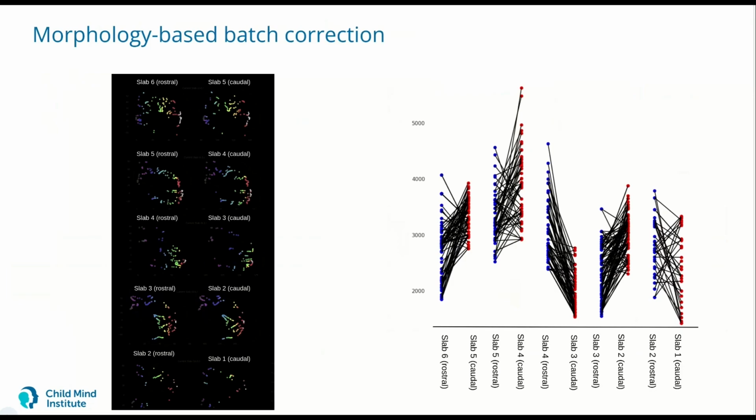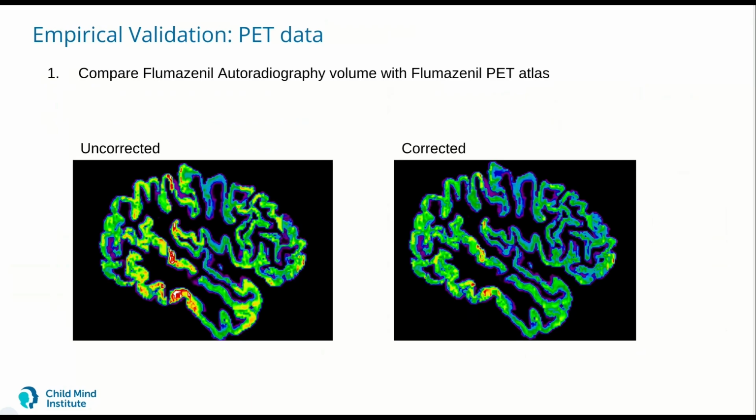To maybe illustrate that for you a little bit, here we have the paired vertices in each of the adjacent bits of cortex. Here we have the rostral portion of slab 6 and the caudal portion of slab 5, and the vertices with the same colors are the ones that are paired together. What this looks like in terms of measured intensities is what you see here. We do have what look like very significant mean shifts between what should be nearby vertices. And so we can use this to correct the slabs of tissue. To see what the result looks like, here we have again the uncorrected image, and then after batch correction, it looks much more continuous. There might still be some underlying batch effect, but it's at least much attenuated compared to what it was before.